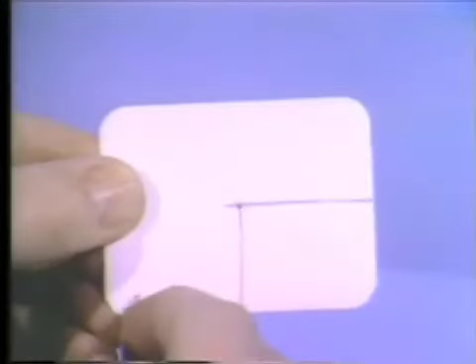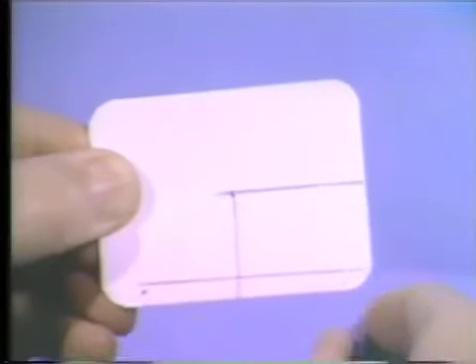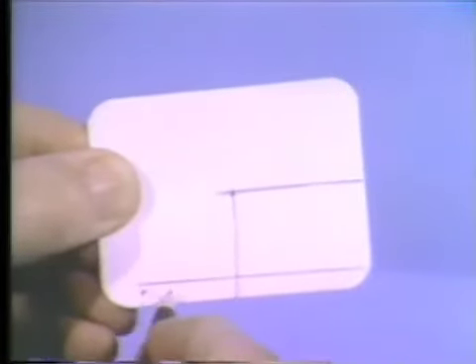Note the relationship to the corner dot. Finally, a line is drawn paralleling the border 1/4 inch from the edge. Note that the corner dot is within the border segment.